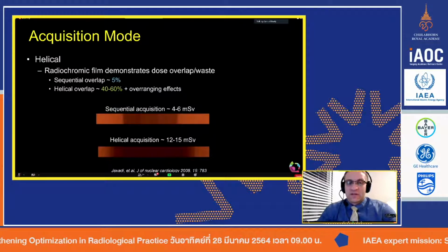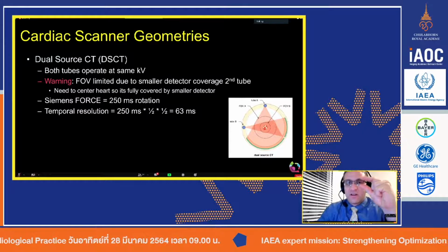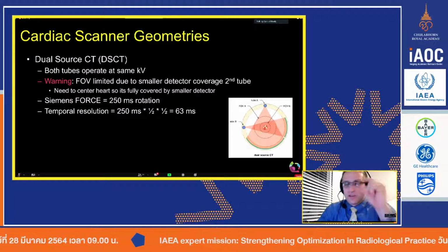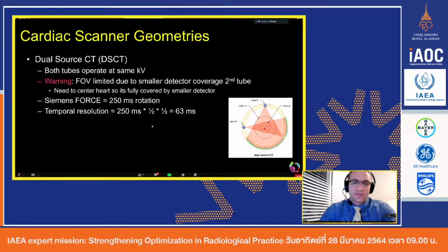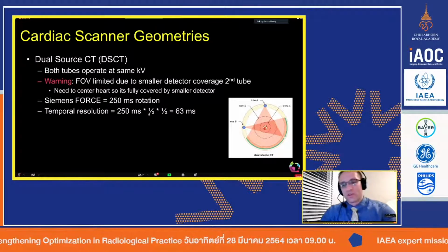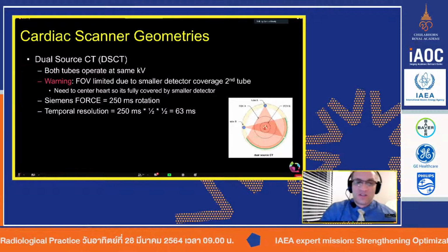But if you still have the limitation of just a 4 centimeter scanner, then doing that step and shoot is, by way of dose, still probably one of your better options. But once again, that's just if you still have those older scanners. Many may still do.